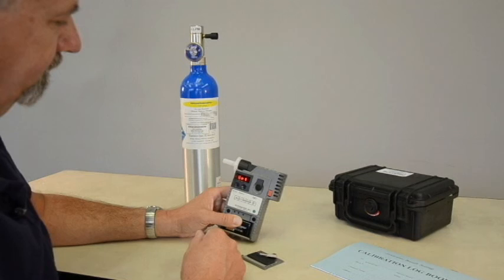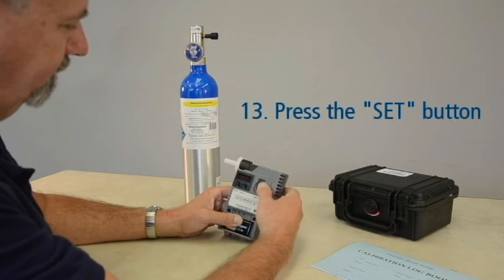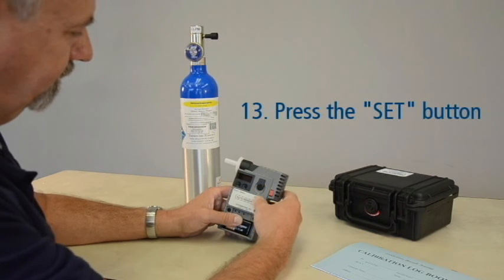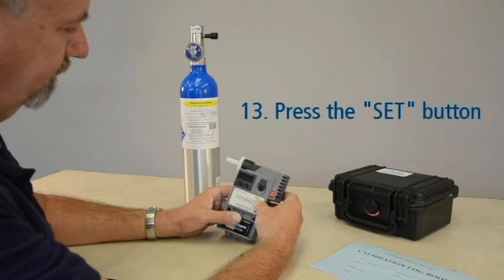When the instrument flashes SET, press the SET button. This ensures the fuel cell sampling chamber is in a closed position and the device is ready for the next test.